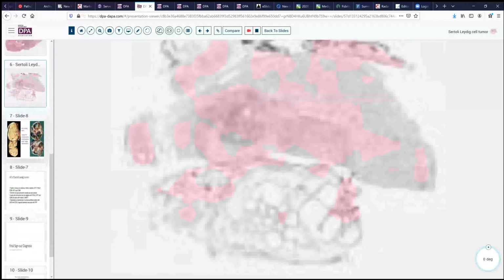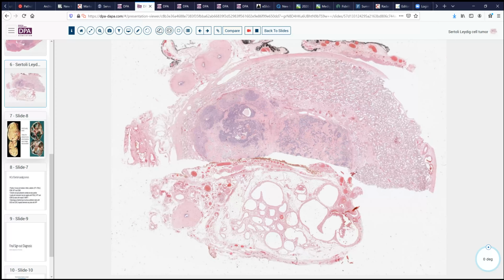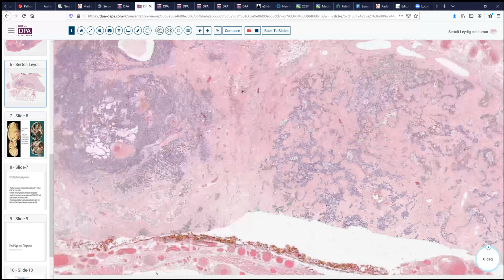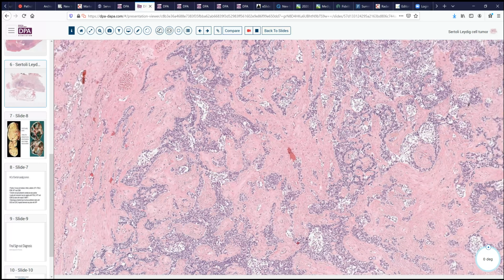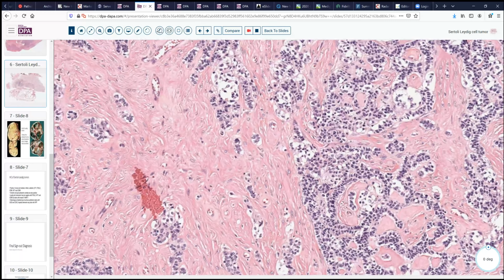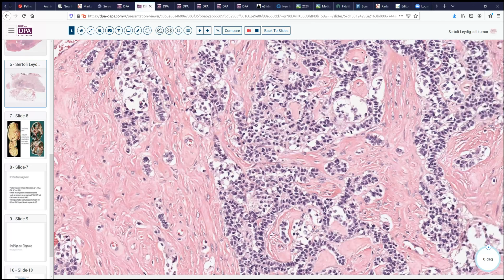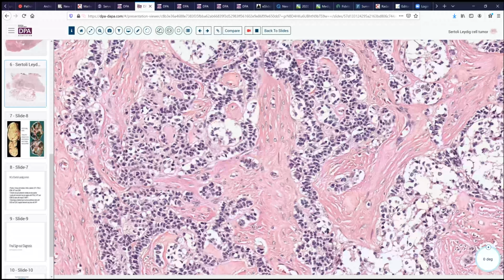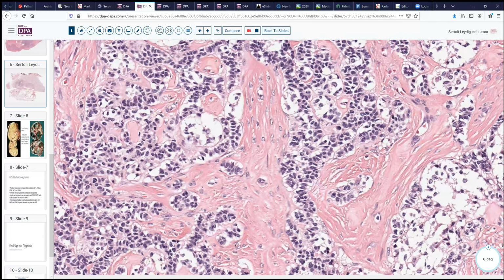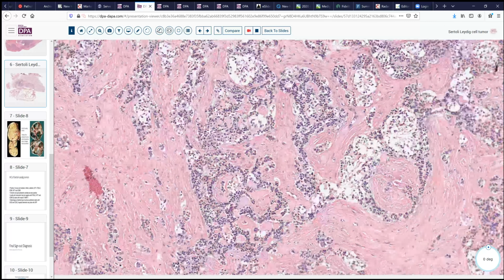Now, of course, the ovary is not the only location where these tumors can occur. And here's a nice section of testis with an area of tumor, again, having this mixed solid, variably cystic, sclerotic pattern that you can see here. We don't see the retiform pattern, but we see these nests and cords of cells here with quite clear cytoplasm, much more closely mimicking the Sertoli cells that line the seminiferous tubules. And these, particularly in a male patient, look very similar.